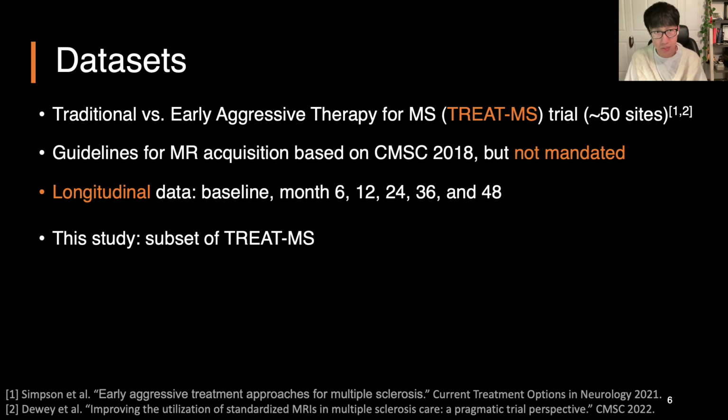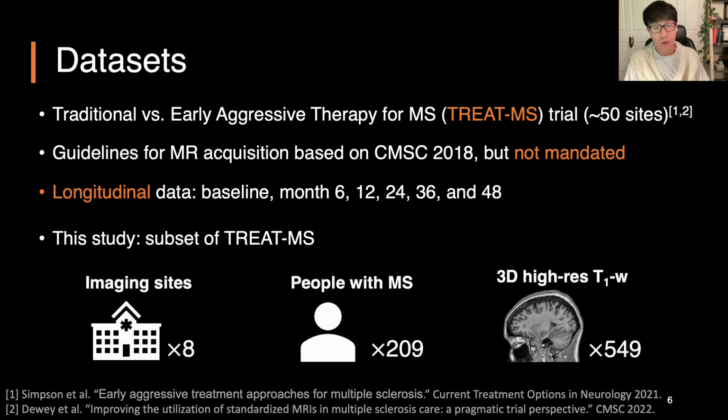And this study will use a subset of the TREAT-MS trial. Specifically, we have 8 imaging sites, more than 200 subjects, and also more than 500 3D high-res T1 weighted images.